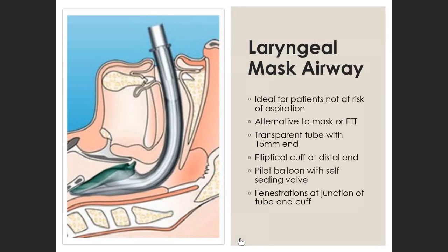And therefore a secure airway could be an endotracheal tube or a tracheostomy tube. Don't forget the tracheostomy tube. Sometimes we think only of the endotracheal tube. Right? So this does not afford a secure airway. When saying that, however, the marked increase in aspiration that they expected when the laryngeal mask came onto the anesthetic scene has not materialized. So it's actually a lot safer than they first thought.